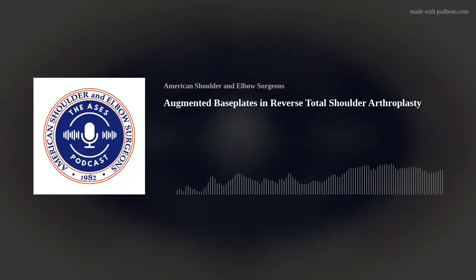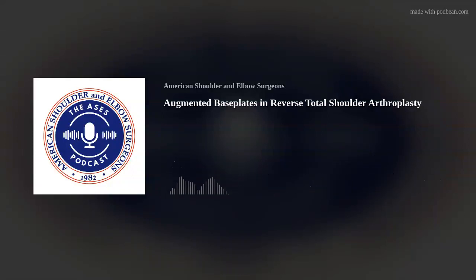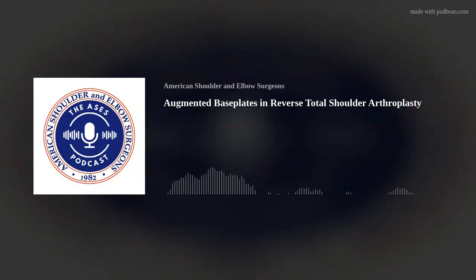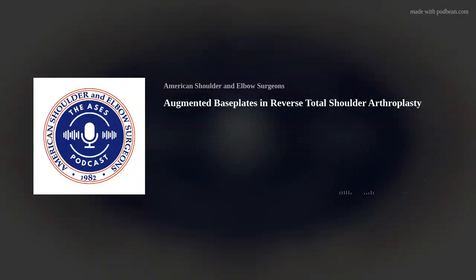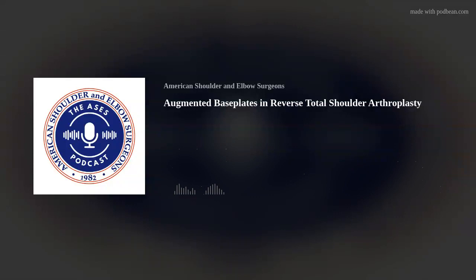That's shame on me. But the reality is, with the system that I use, I feel like I can get enough of a tilt with my base plate and the amount of lateralization with my glenosphere, that should provide good stability. I do worry about lateralizing it more than that with built in on your base plate and potential for acromial stress fracture. But yeah, these are a little bit worse for stability compared to the other patient population that we're dealing with.